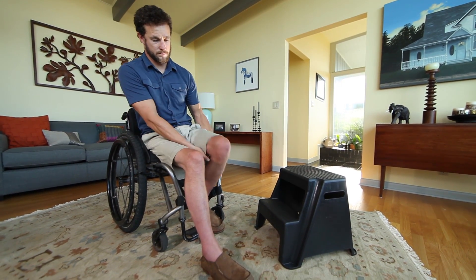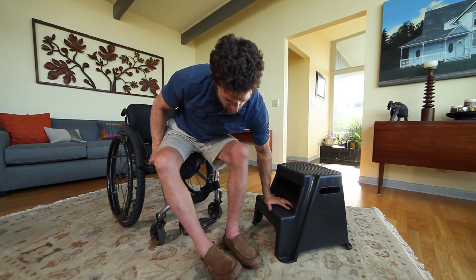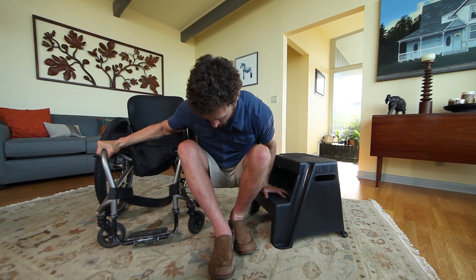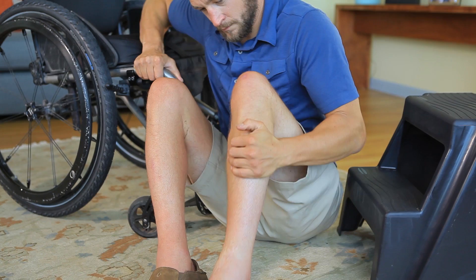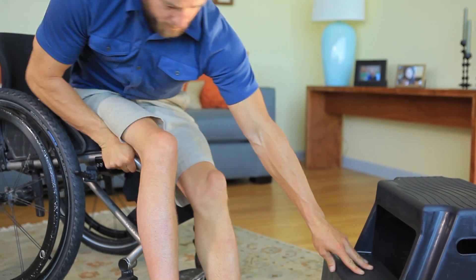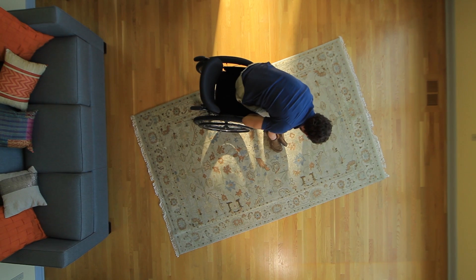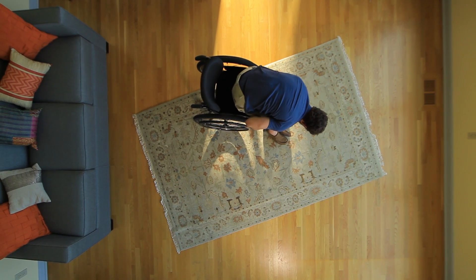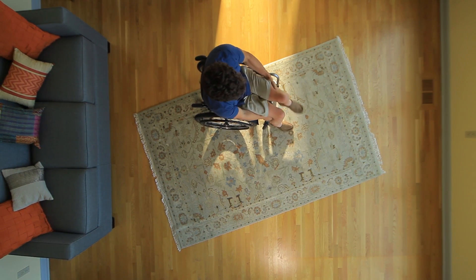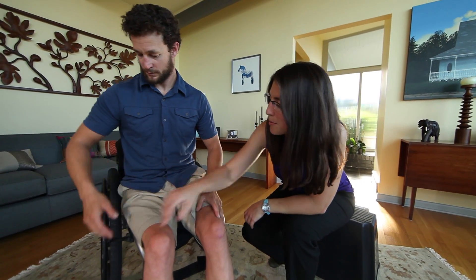With this method, set the stool diagonal to the front of your wheelchair. Your trailing hand will remain on the wheelchair frame, but your leading hand will be on the stool instead of the floor as you move toward the ground. When you return to the wheelchair, place your trailing hand on the stool instead of the floor. Whether or not you use a step stool, consult with a physical or occupational therapist who specializes in spinal cord injury as you try this strenuous but useful transfer.